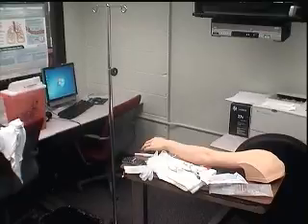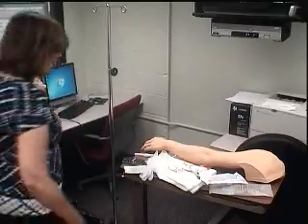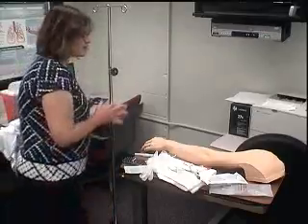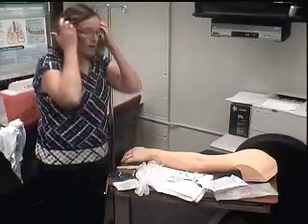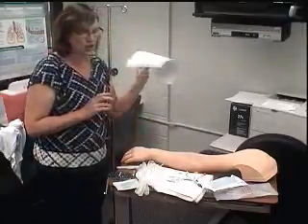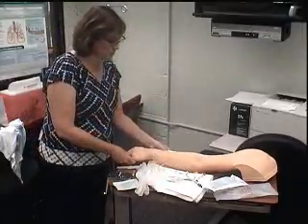Okay, I'm going to show you how to put in a saline lock. We're going to put in a saline lock, hang some IV fluids, and then we're going to discontinue the IV today. So the first thing, we're going to be going by this checklist. We're going to do the skills performance checklist.